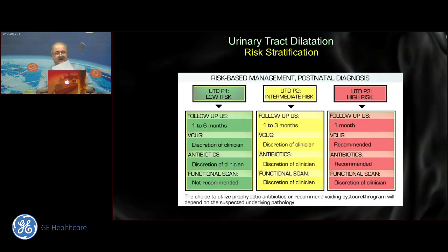I know we're running out of time, but if I may be allowed to take just 2 questions. At 30 weeks, kidney sizes are 41 to 43, fetal weight 93rd percentile. How to do counseling of parents? We not only go by the actual value, we also go by how far it is from the median, and someday we might even come up with multiples of median.